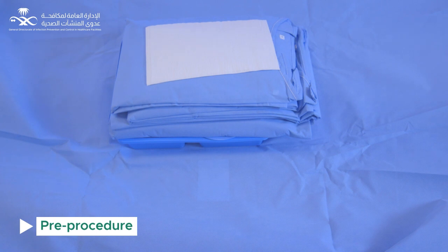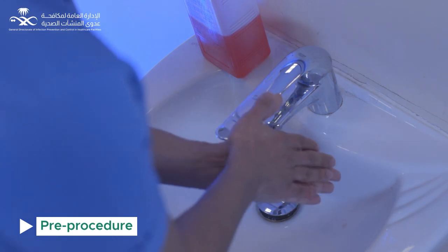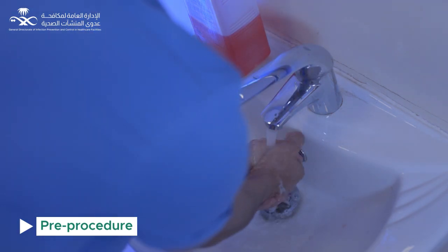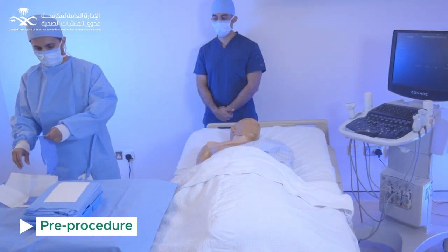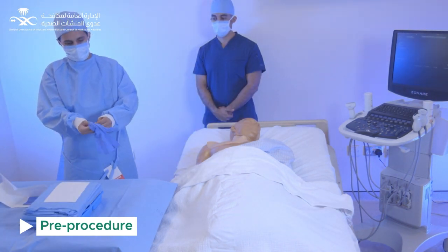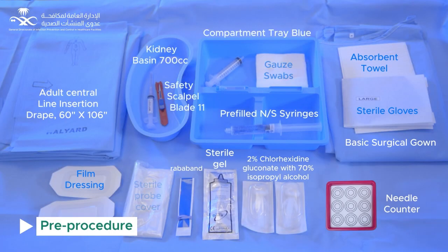After disinfecting the trolley with approved surface disinfectant, wear head cap and face mask. Perform hand hygiene by washing hands with antimicrobial soap and water. Using an absorbent towel, wear a surgical gown with the help of the nurse's assistant, and wear gloves. Set up the sterile trolley and make sure all required items are prepared.